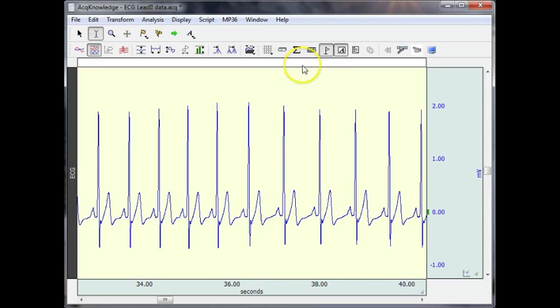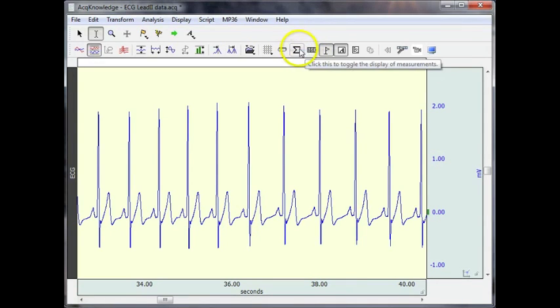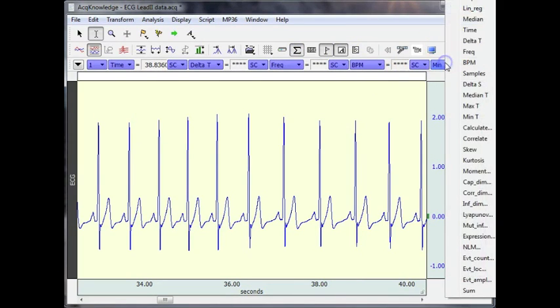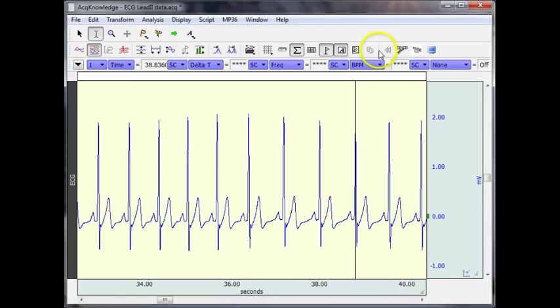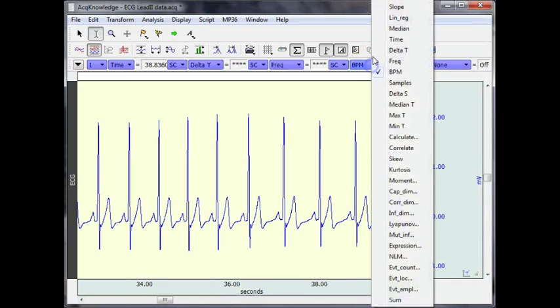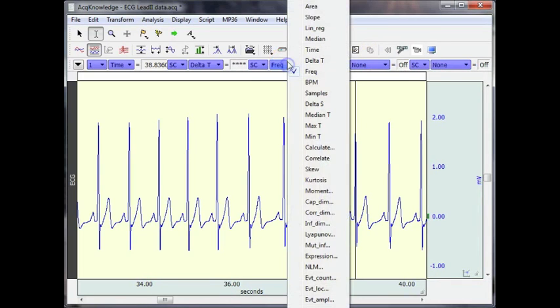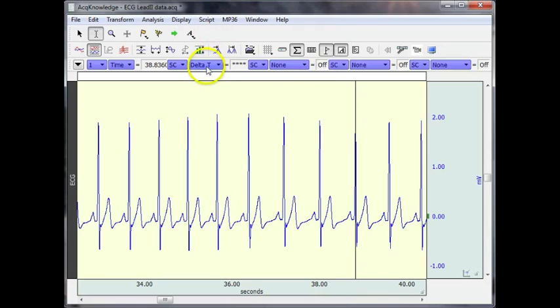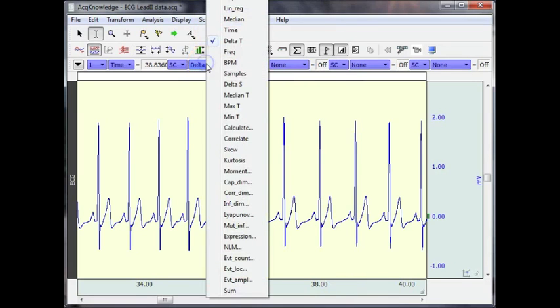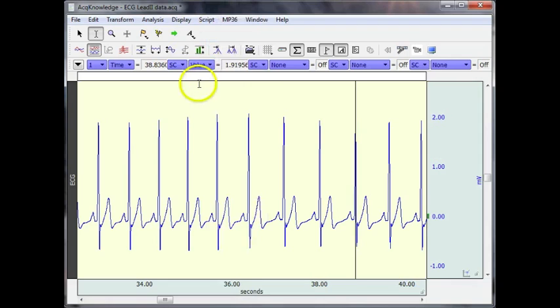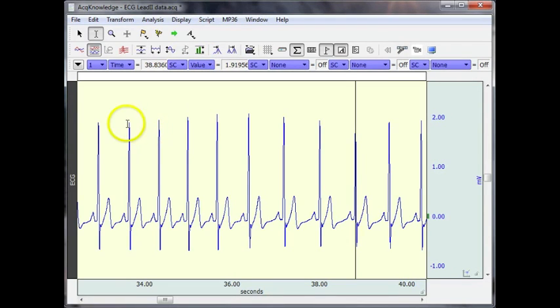One of the nice things about the peak detector is its ability to take a measurement. So I'm going to turn my measurement boxes on and I'm going to turn some of these off. I don't need them all for what we're going to be doing.